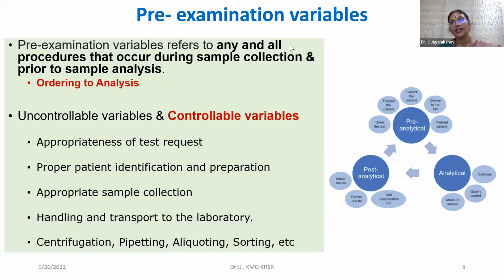Now, what are these controllable variables? Here, I've also shown you in a picture what are the things that you would see in the pre-examination, examination, and the post-examination.